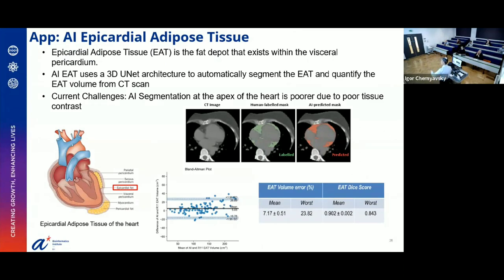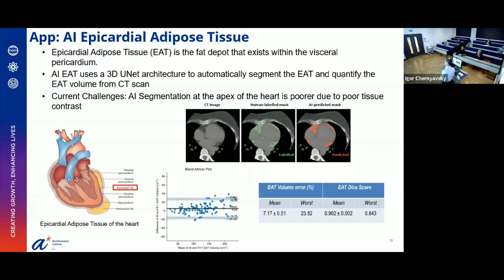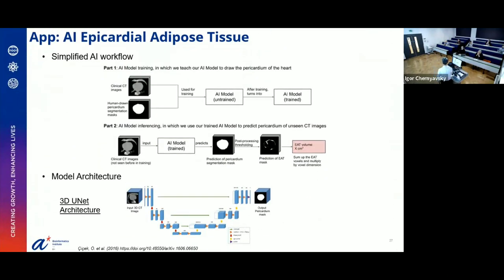The AI epicardial adipose tissue (EAT) module quantifies the fat near the heart, especially near the arteries. We show the image alongside human labels. The mean volume error is 7% and the DICE score for segmentation is 0.9, which is very good. However, we focus on worst-case performance, which is 23% — not ideal. We want to reduce the worst case to around 10%. The model we use is 3D UNET++.